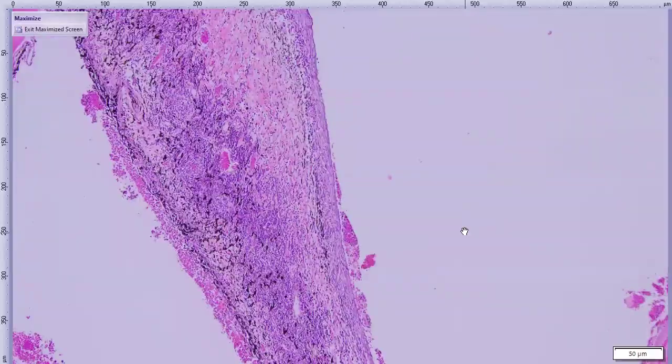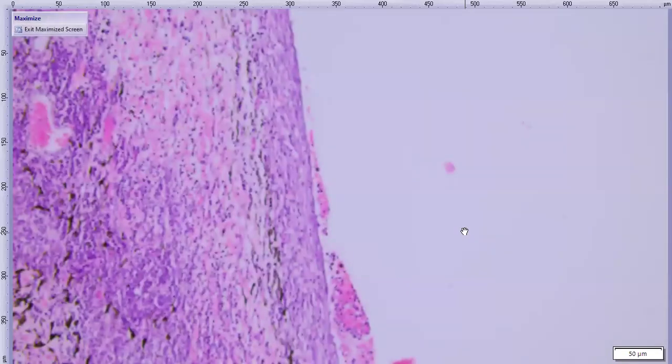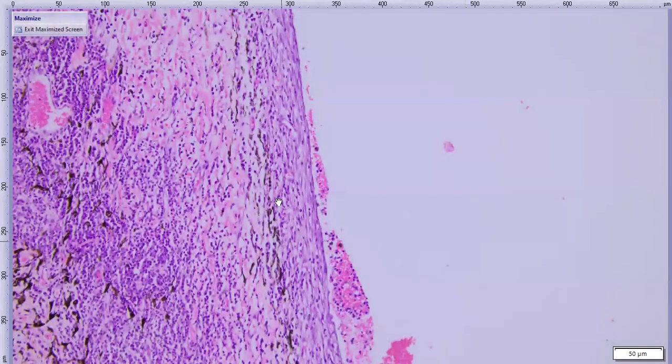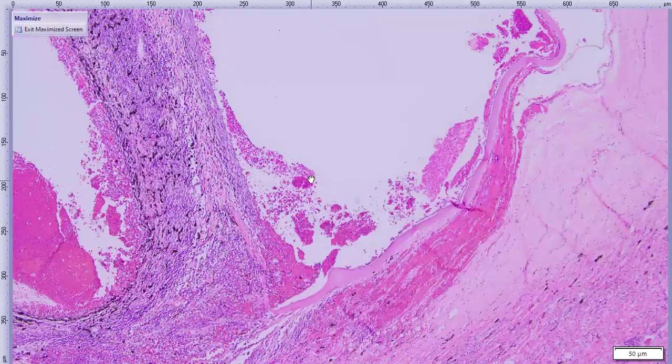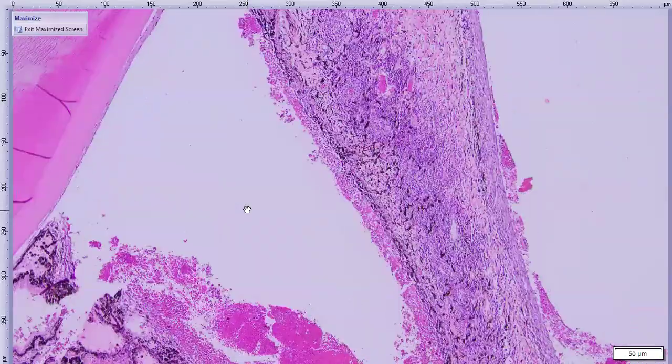As we move to the iris, first there's that membrane that's sitting on top of the anterior aspect of the iris. Here's maybe the anterior margin where all these melanin-laden cells are. And then we have this fibrovascular membrane, which is pretty robust, lining the surface. And there's areas where it looks like it's crossing the iridocorneal angle, causing anterior synechia. So we have a great reason for glaucoma already in this case.